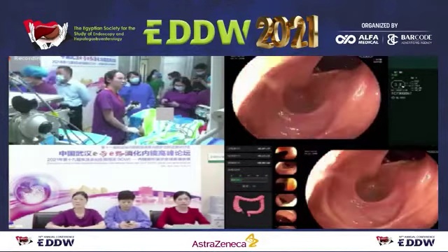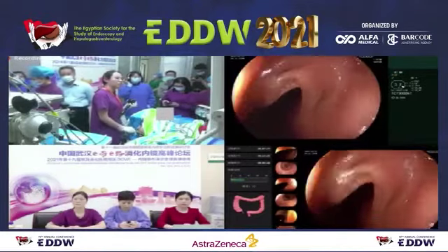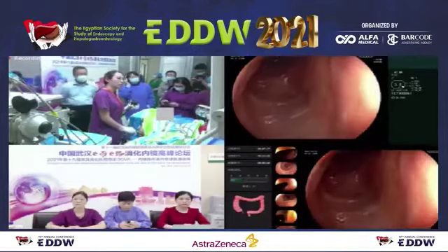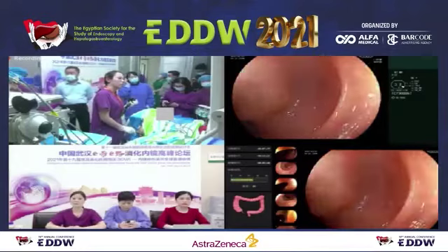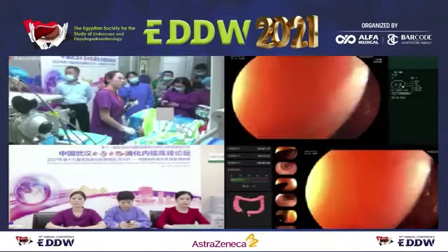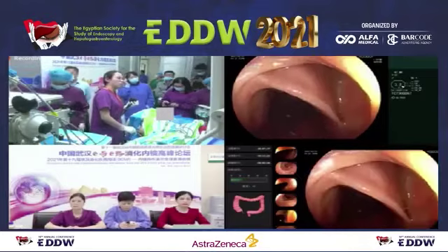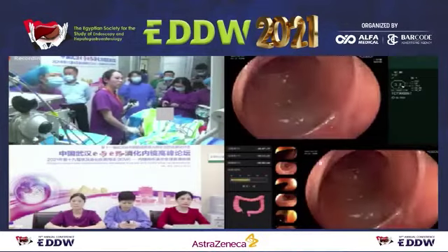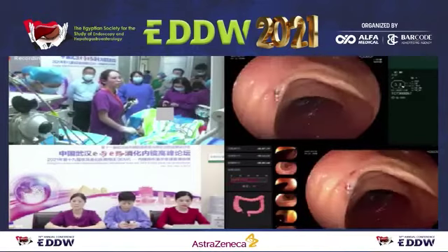It is important to understand small lesion. You should use cold snare, not biopsy, because in the past we sometimes used biopsy. From the pathology point of view, biopsy is not nice. So small lesion, cold snare, and when it's a larger lesion like that, you could use ESD or mucosectomy. Yeah, that's what we just do for the common work.